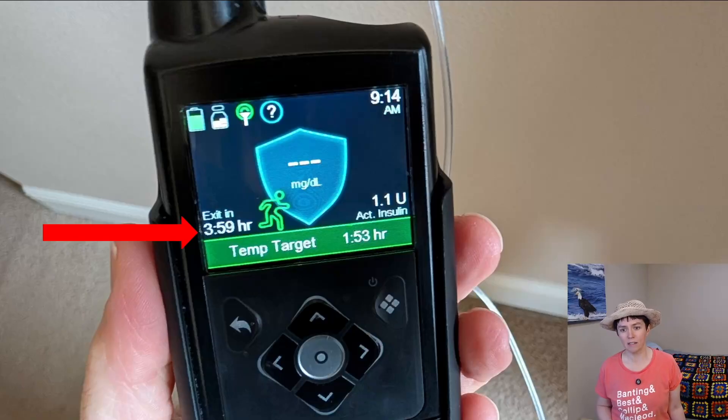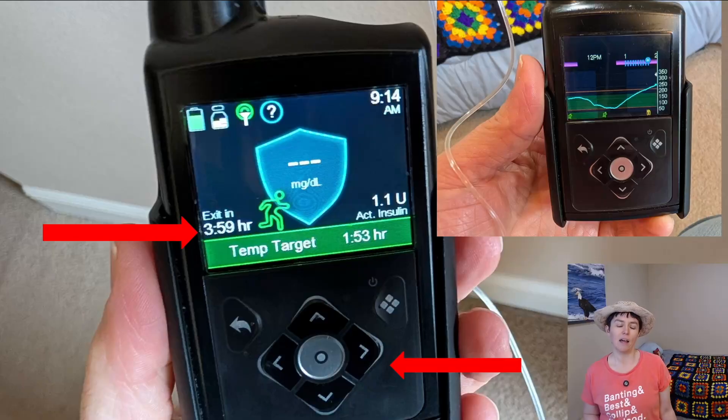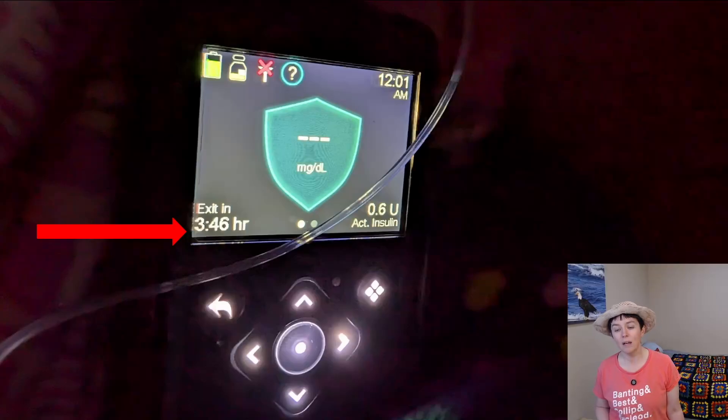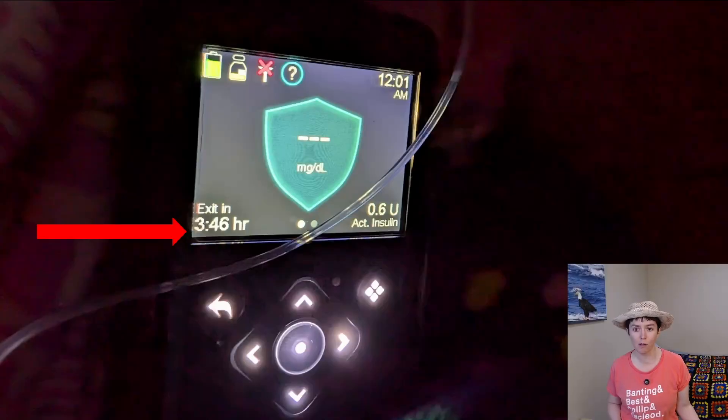One minute is no big deal — it happens fairly frequently, it's kind of annoying, but you just press that arrow button and you can see the graph of what your blood glucose has been doing. You're probably running into issues where there's no sensor signal for a longer time, like this one in this photo — it was about 14 minutes of no sensor reading. Sometimes you might see the X symbol on the transmitter symbol at the top of the screen as well. This is not an urgent situation unless you don't have another way to check your blood sugar and you're going low.